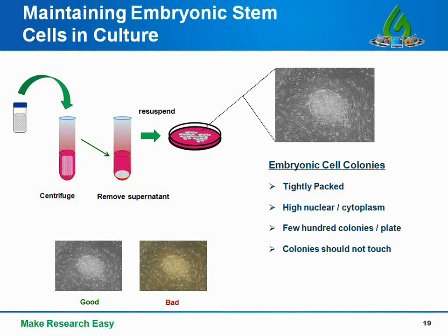So split your embryonic cells every 2 to 4 days. It is critical that embryonic cells are healthy when splitting. Now, if you notice at the bottom of this slide, if the media starts to change color to an orange or yellow, then differentiation is starting to occur, and these cells should not be split. However, if you split your embryonic cells regularly and use the right combination of growth factors and cytokines, you can expand your undifferentiated embryonic stem cells as long as you like.